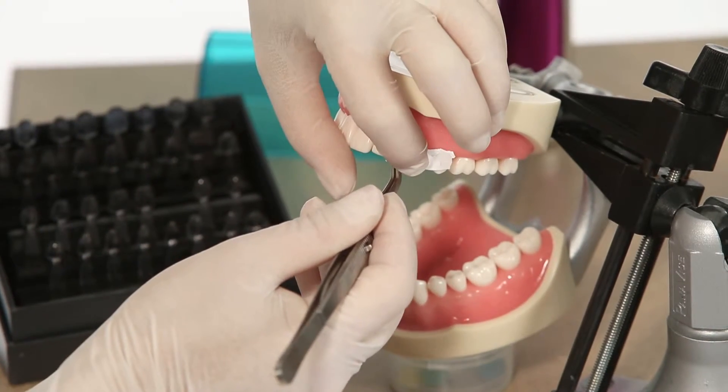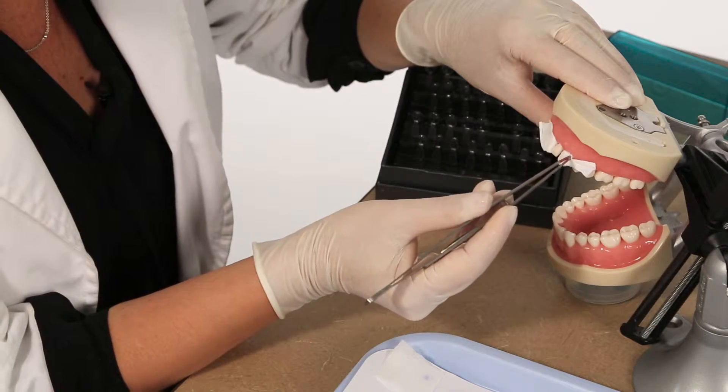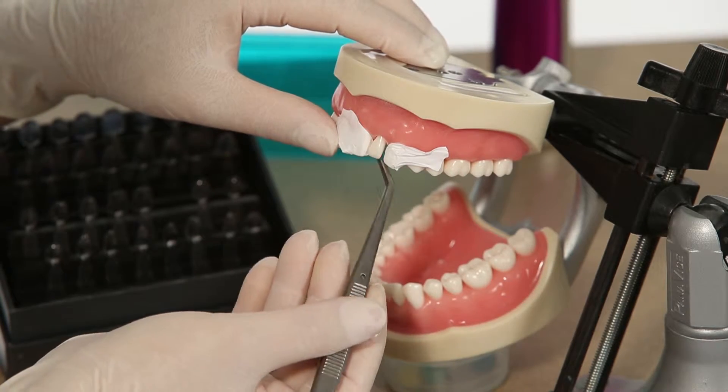Place an interproximal separator such as Mylar strips, Toffelmeyer, or Teflon tape to isolate the tooth for the procedure.